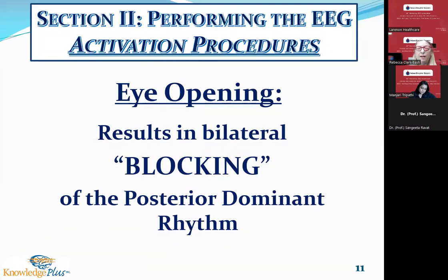Now, I just want to say one thing about this blocking effect. If the patient has unilateral PDR, posterior dominant rhythm blocking, over the occipital leads O1 and O2, it would mean that the patient opens their eyes and the posterior dominant rhythm is only present on one side. If that were to happen, and it were the only abnormality in the recording, it is not considered significant. The same will be said for unilateral photic driving. Again, if it's the only abnormality in the recording, it is not considered significant.